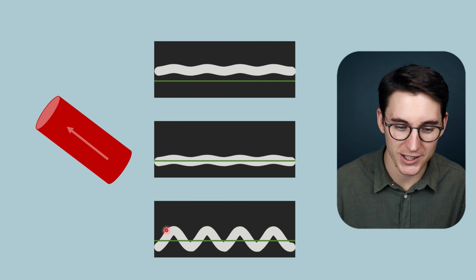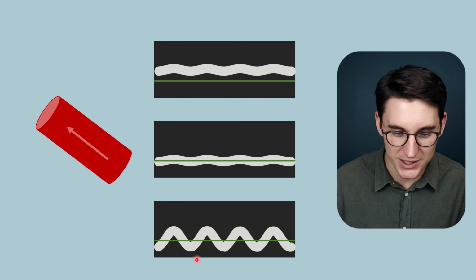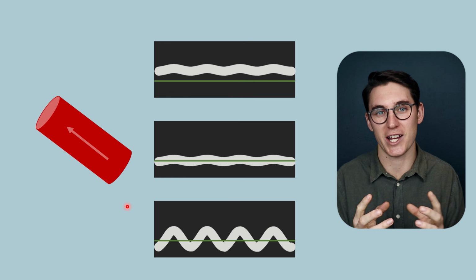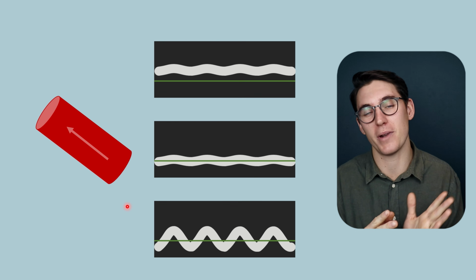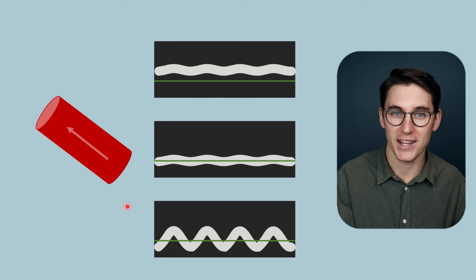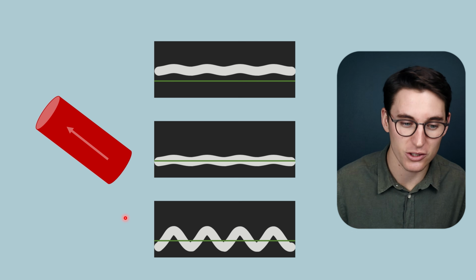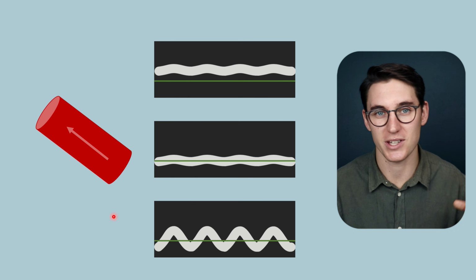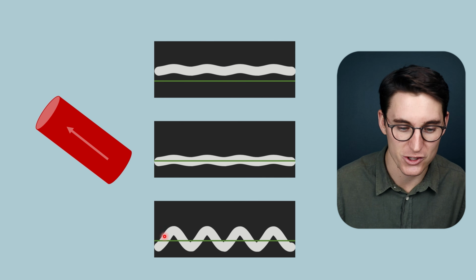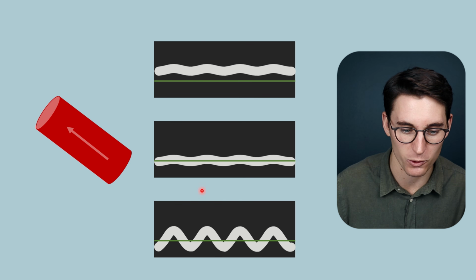We can also get an increase in the variation within the blood flow in the portal vein. And this occurs in something like tricuspid regurg, where the heart goes through a systolic contraction and there's actually reverse flow of blood through that incompetent tricuspid valve down into our venous system, into the inferior vena cava and into the liver. And we can see that there's some reversal of flow with those increased pressures within our inferior vena cava. So during systole, there's reversal of flow, and during diastole, we are getting that normal flow that we were seeing in our initial waveform here.